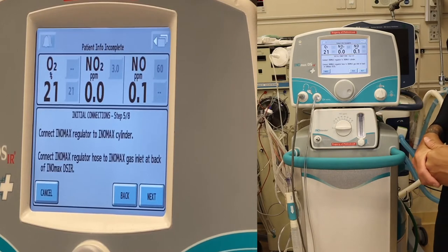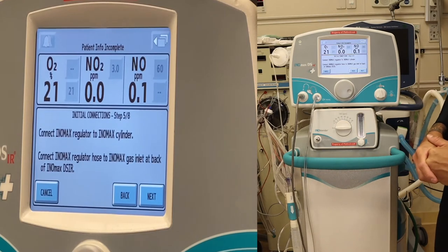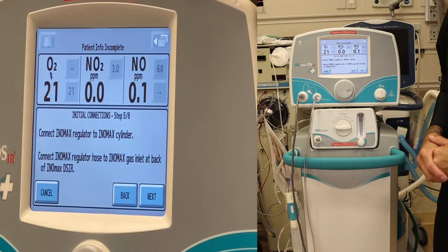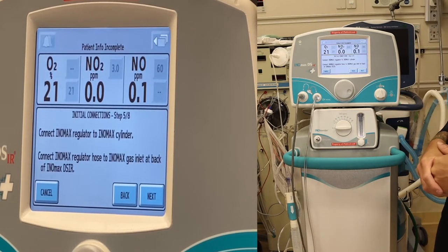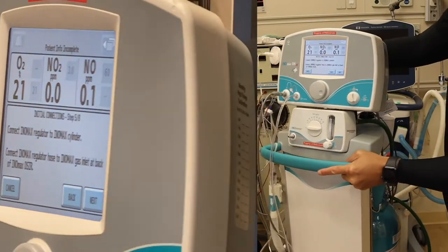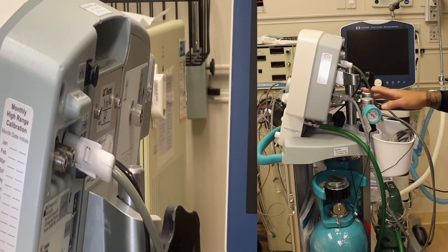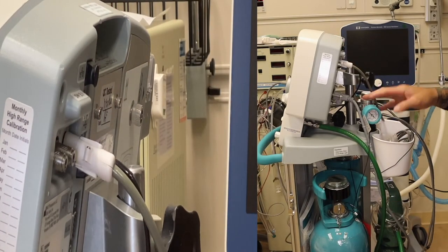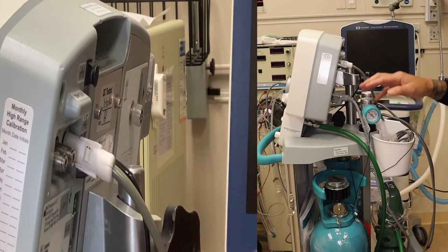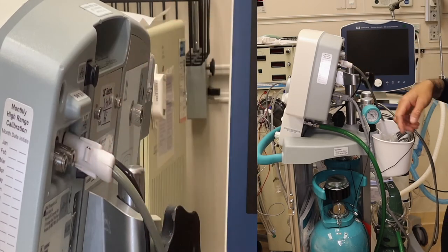Connect the INO MAX regulator to the INO MAX cylinder and connect the INO MAX regulator hose to the INO MAX gas inlet at the back of the machine. You'll find two different regulators — one for your left tank, one for your right tank — and two inlets: the left side for your left tank, the right side for your right tank.